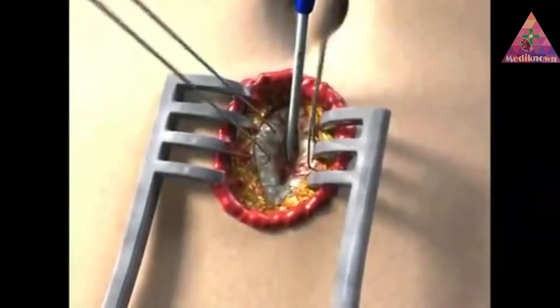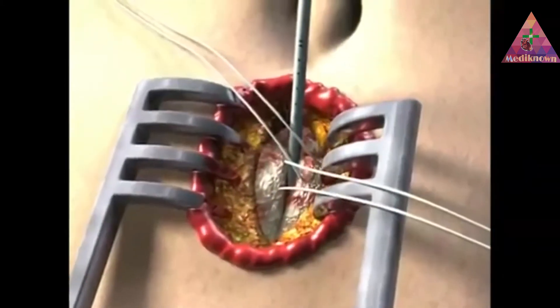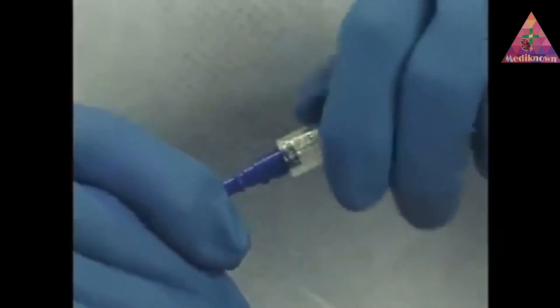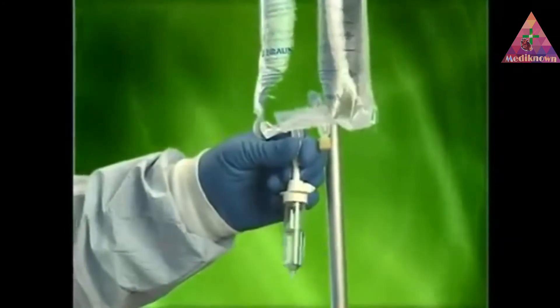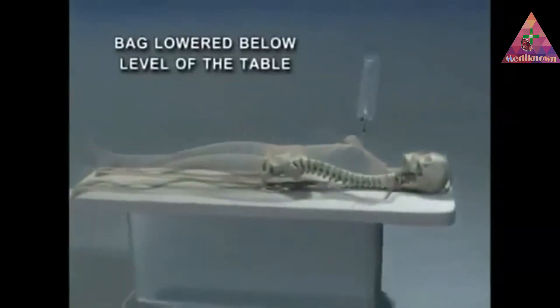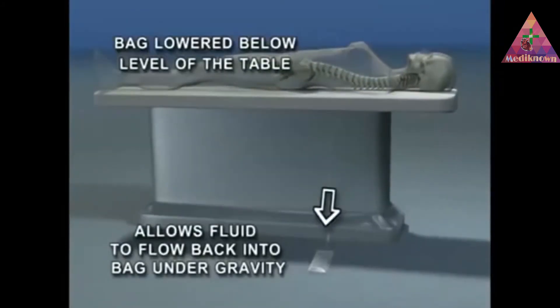The two stay sutures are then crossed to create a tight seal. A liter of normal saline is then allowed to flow into the abdomen under gravity — it should not be forced in under pressure. The entire bag is not allowed to empty; a very small amount is left in the bag and the bag is lowered below the level of the table to allow the fluid to flow back into the bag under gravity.